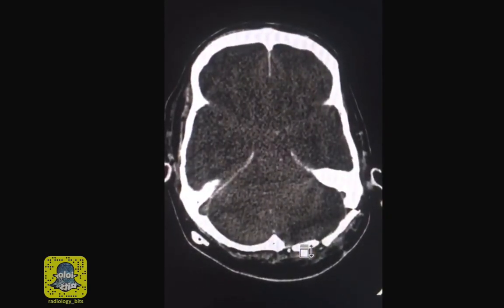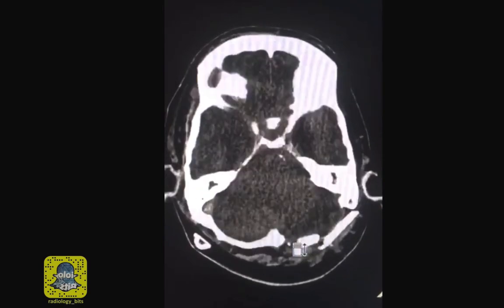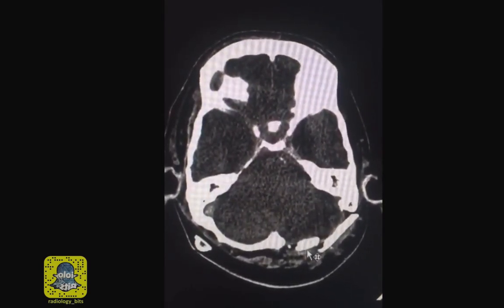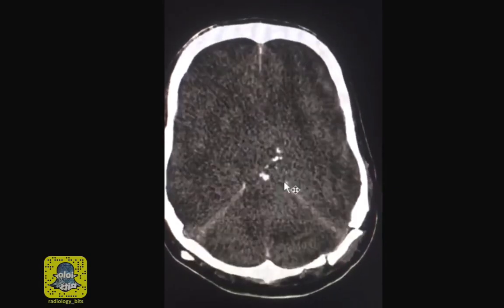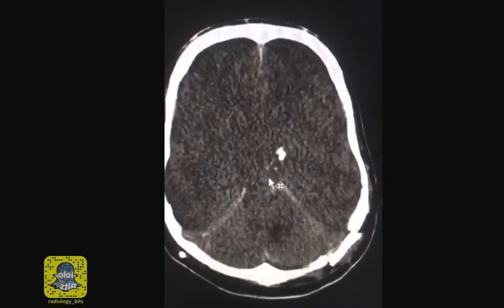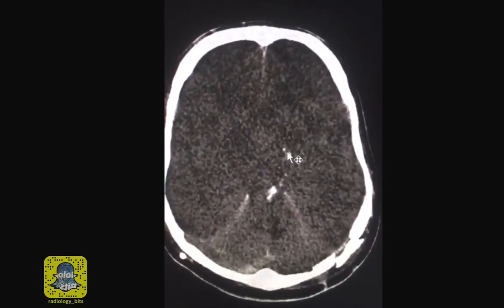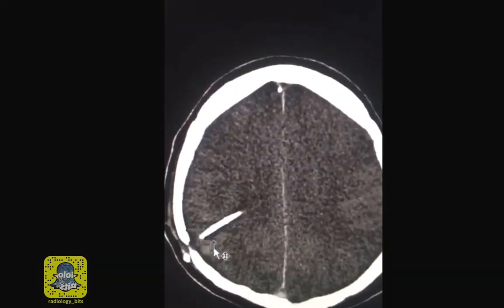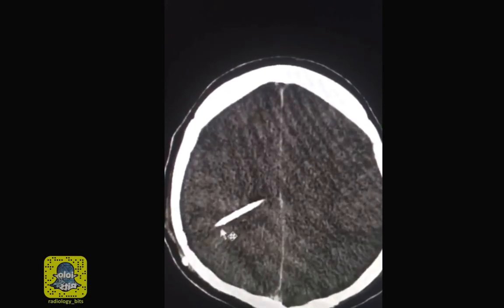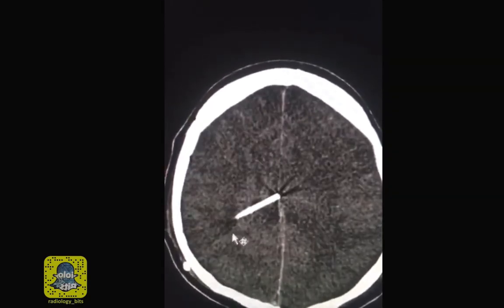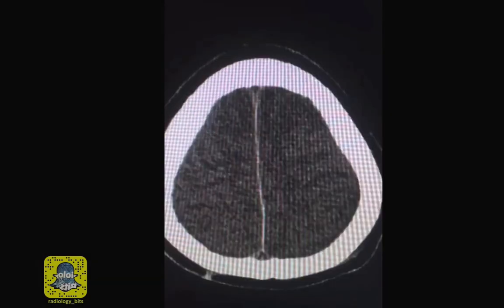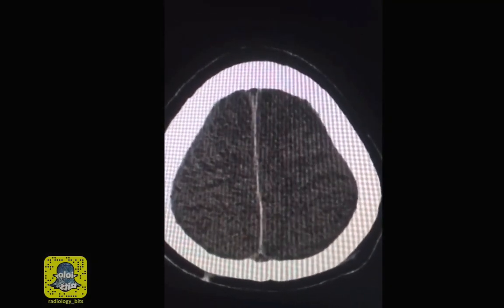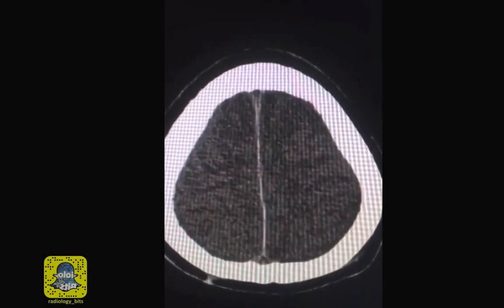There are expected features of prior surgery as you see here. This is a left occipital craniotomy. In addition you see those foci of dense material which are related to surgical packing. There is also a ventricular peritoneal shunt. This is all known clinically and expected, and it's not the reason why I'm showing you the case.